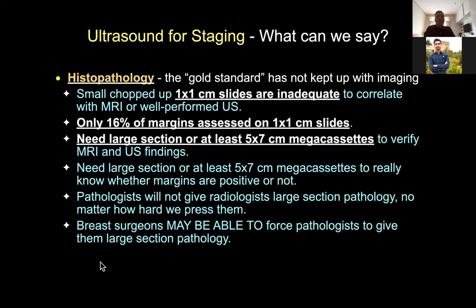The last thing I want to say is that ultrasound staging and MR staging are limited by the imperfections in the way pathologists look at histology today. The gold standard for pathologists is to chop up the specimen into tiny little pieces and mount them on slides that have just 1x1 cover slides. And that really does make it difficult.